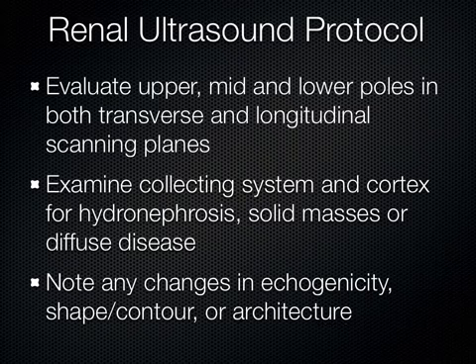You don't have to worry so much about the pathology this year. That's really for next year. But eventually you're going to be looking for problems in the collecting system, in the cortex, cystic structures, solid masses, and diffuse disruptions in the kidney, things like that.